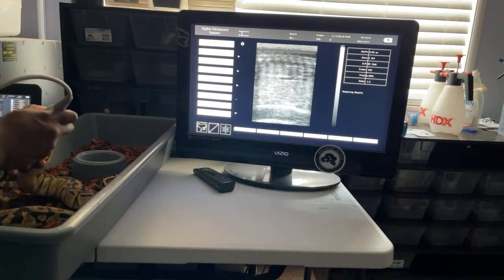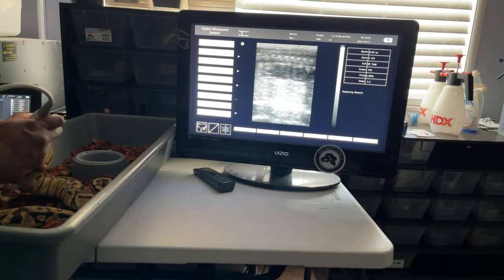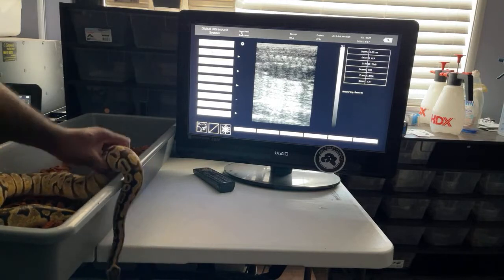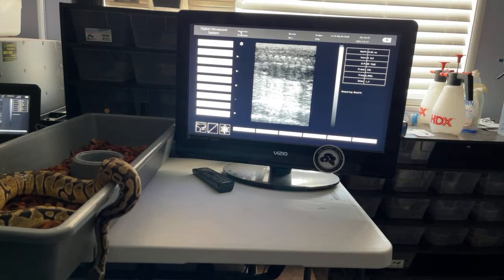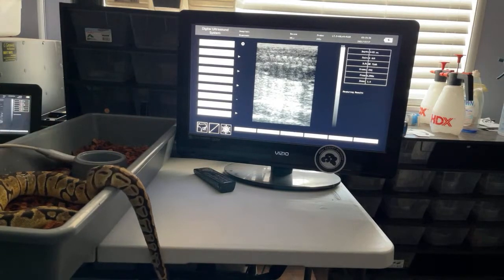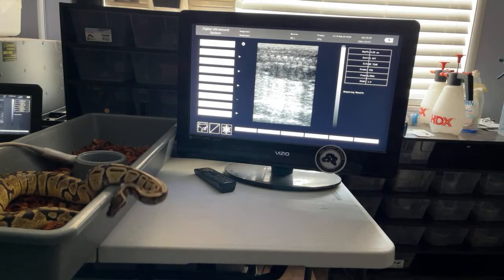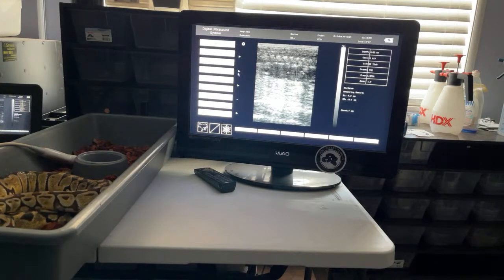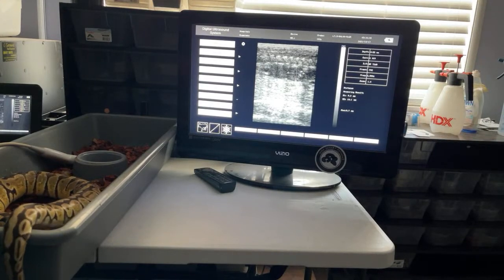That's right there. Okay, so freeze. Those all jumbled together on the screen right now, and I think she's building a little bit. She's going to run off while I do this. I'm actually using a mouse for this too, not that silly trackball. So one here, here. I usually go horizontal and vertical, and that gives a good average of what they are. A lot of people go diagonal, which I don't. So she's got about 9 millimeter follicles right now. She's got one right here, right next to it, and this is probably one behind her on the other oviduct right there.